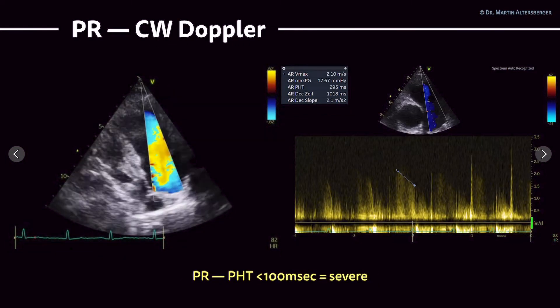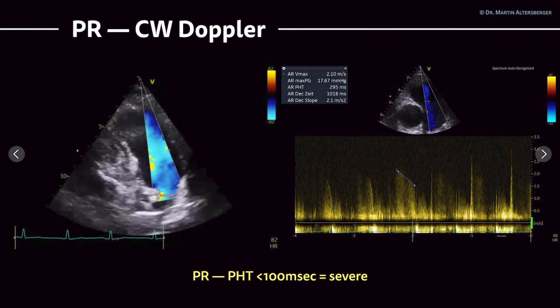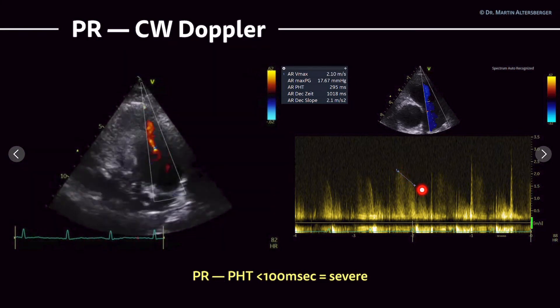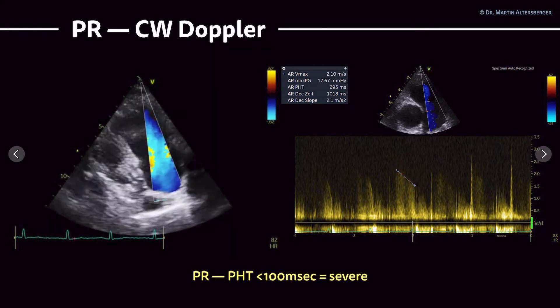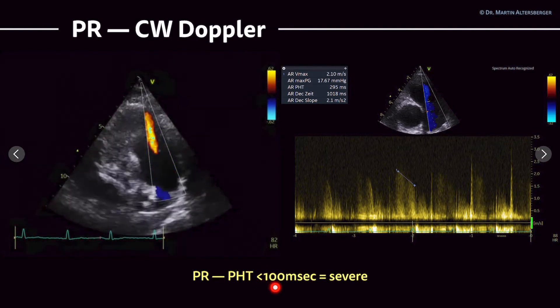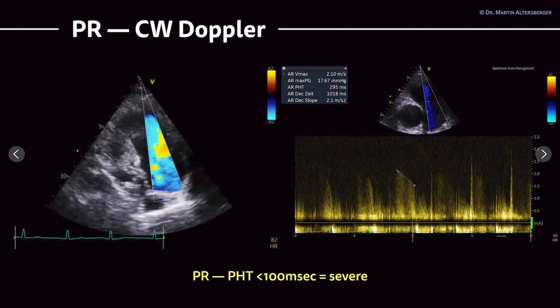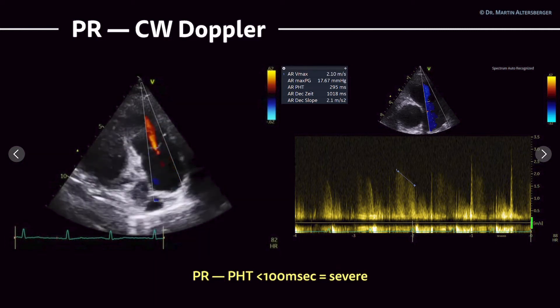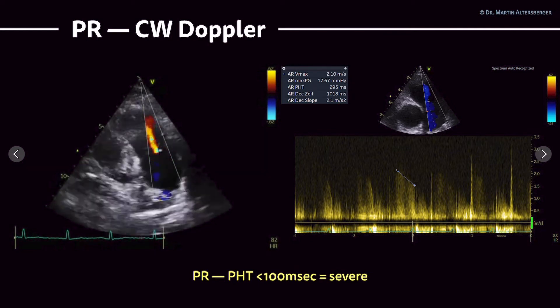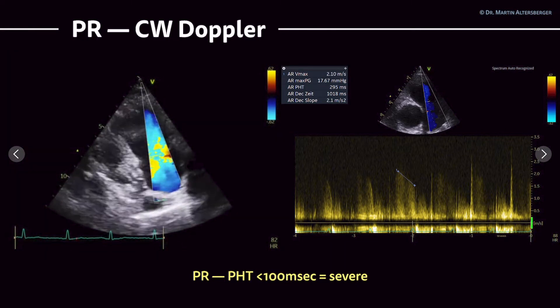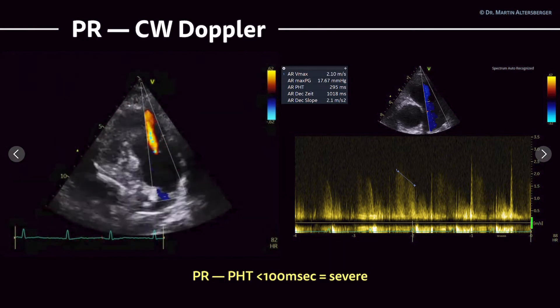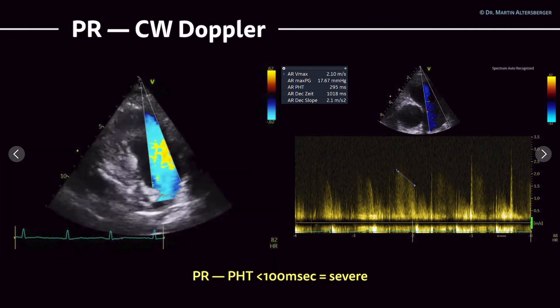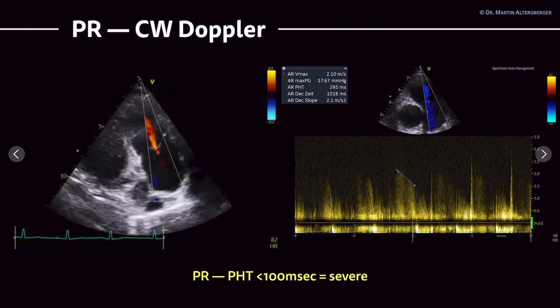Another measurement we can perform is grading pulmonic regurgitation. With pulmonary regurgitation, we can measure the pressure half time — it's the same as with aortic regurgitation. You measure the downslope of the curve, and if this measurement is below 100 milliseconds, it's severe regurgitation. In this case, it's approximately 300 milliseconds, so that's definitely not severe pulmonary regurgitation, which we can also already see in the color Doppler image. The limitation is that this signal is sometimes very hard to get. If you have a truly relevant regurgitation, it's definitely important to perform this measurement, but it will be way easier compared to simply mild regurgitations.